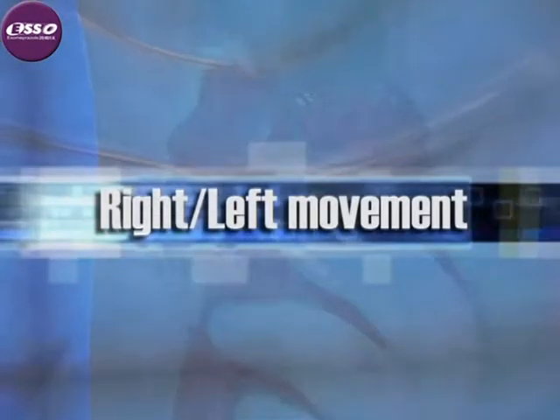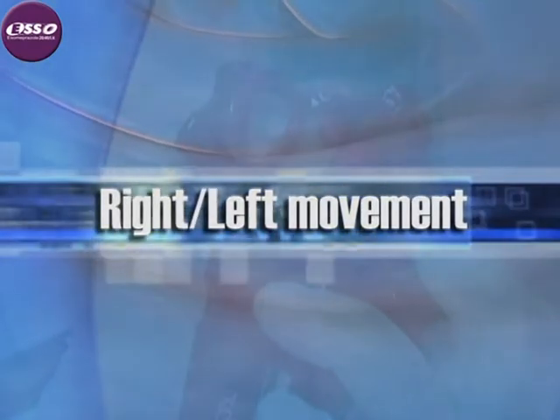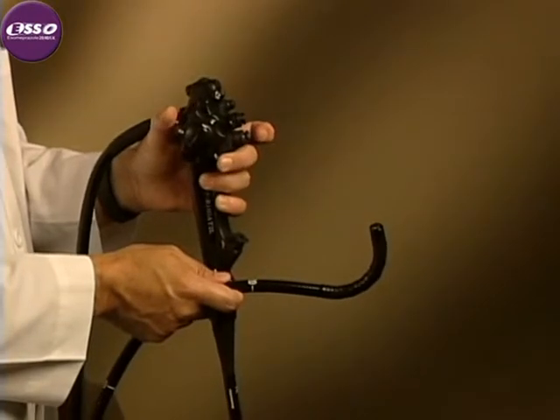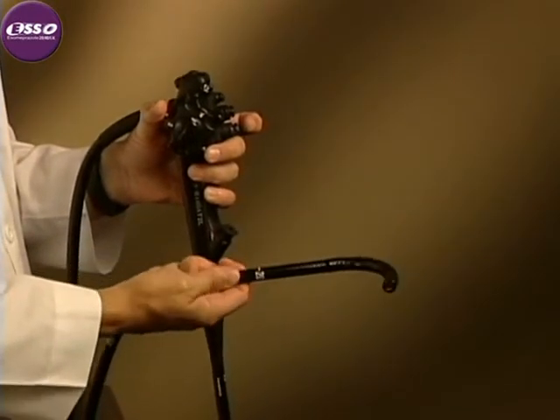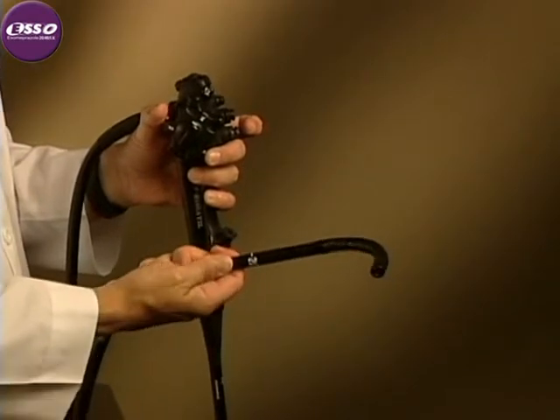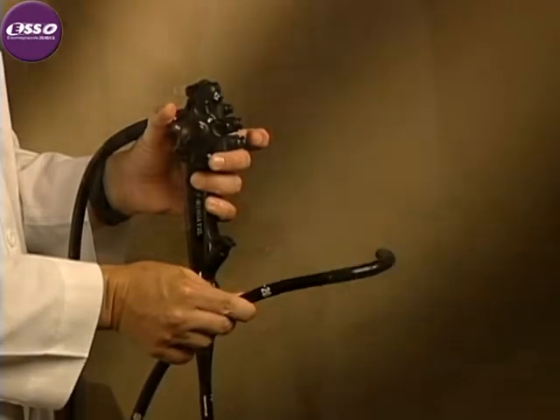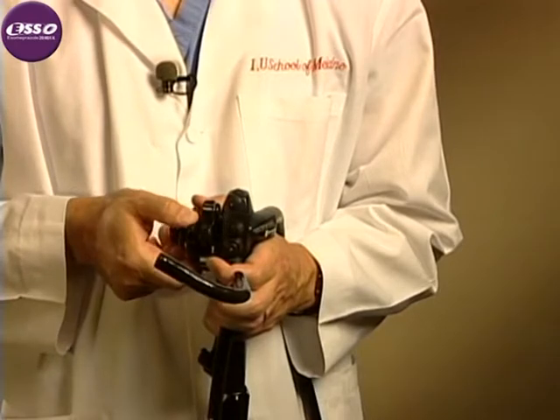There are two ways during colonoscopy to achieve right-left movement of the scope. One of these is by torque. In this maneuver, the colonoscope is deviated in the up-down direction, usually the up direction, and the instrument shaft is torqued with the right hand. This is a fundamental movement during both insertion and withdrawal of the scope. The second method, of course, is to deviate the tip using the right-left control.